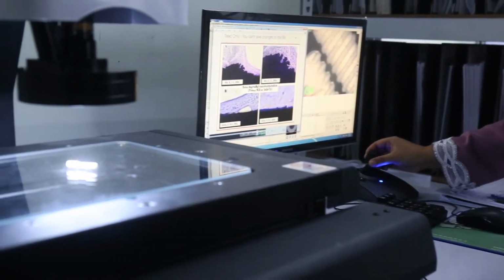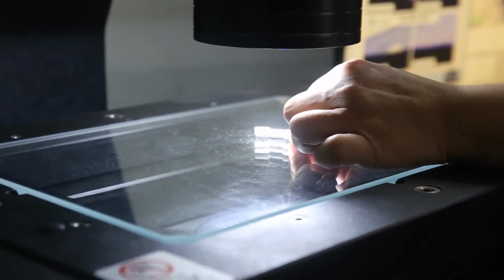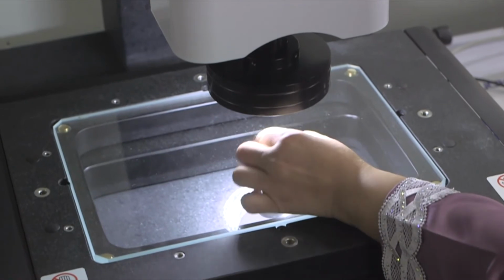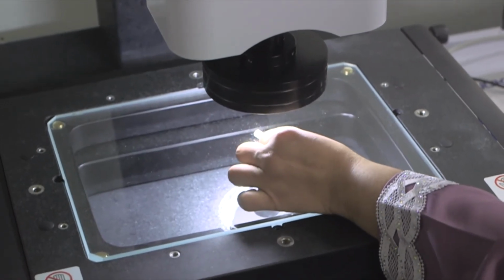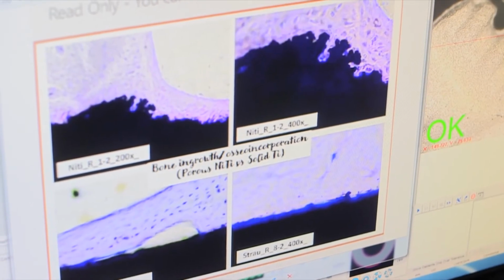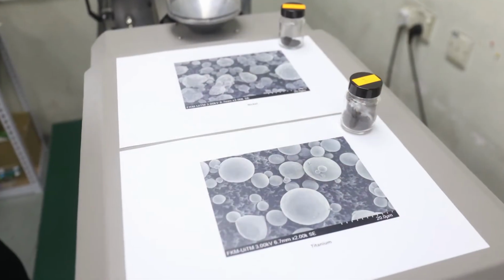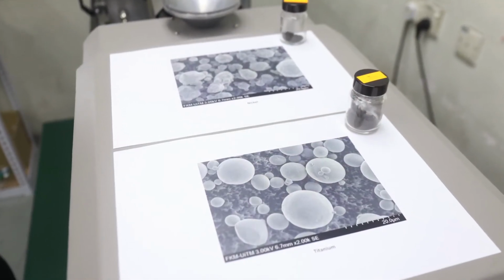rate of the implants. The primary endpoint of this clinical trial is to measure the success rate over a 12-month period. Success of a dental implant means that the implant stays in the mouth and is functioning well. The secondary endpoints will be the stability of the implants, how fast they stabilize over time, the health of the peri-implant condition of the soft tissues and hard tissues around it, and if there is any bone loss at the crestal part, or the top part, of the implants.